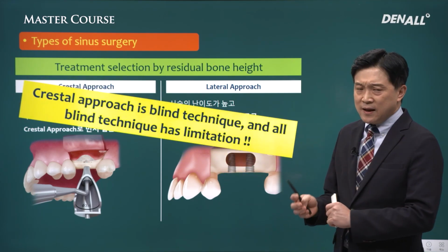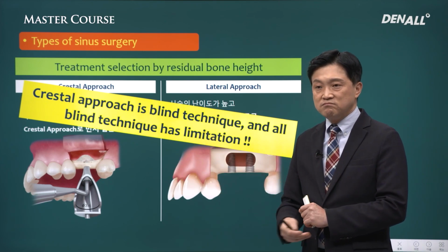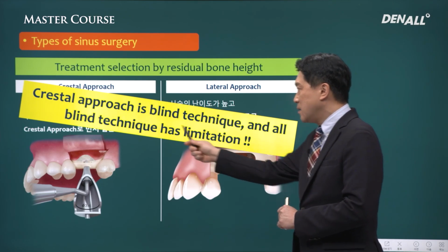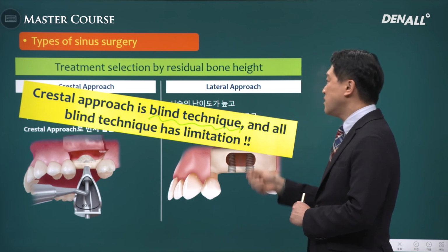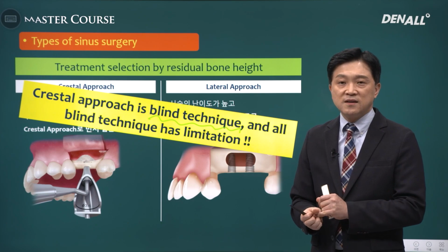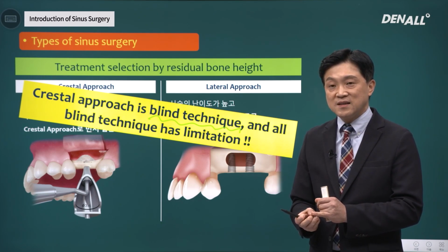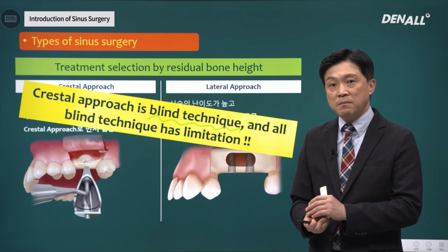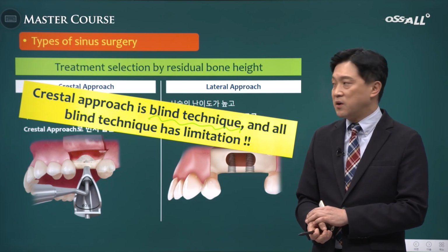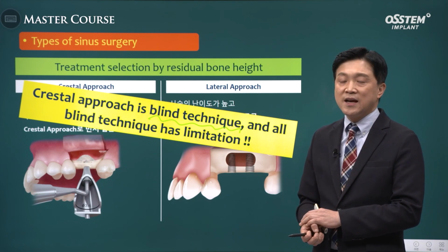The biggest issue is this. Crestal approach is very favorable in many ways. However, it has the critical downside of being blind technique. All blind techniques have limitations. You cannot see for yourself whether the sinus floor has been lifted or whether membrane has been torn. There are limitations with blind techniques, so this needs to be considered.